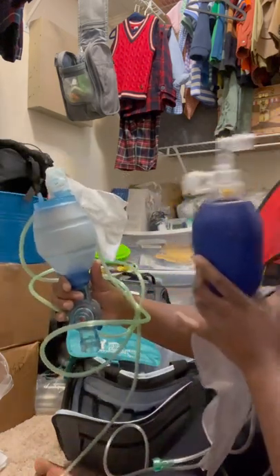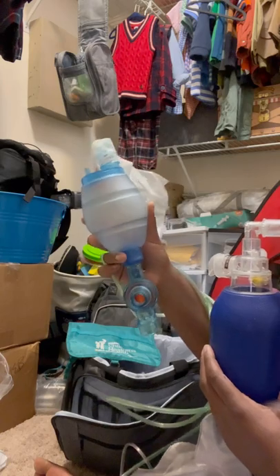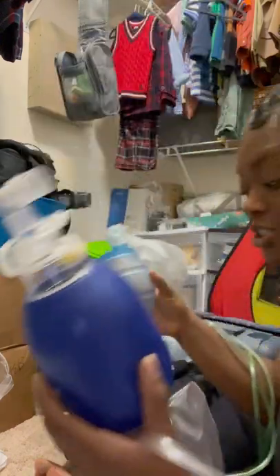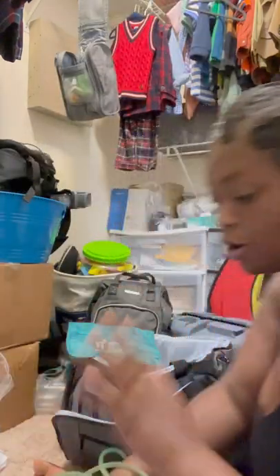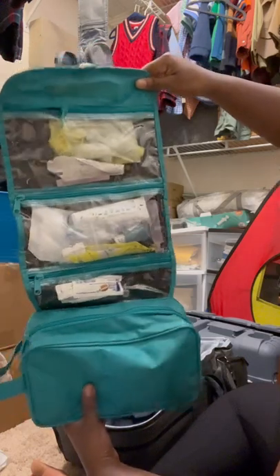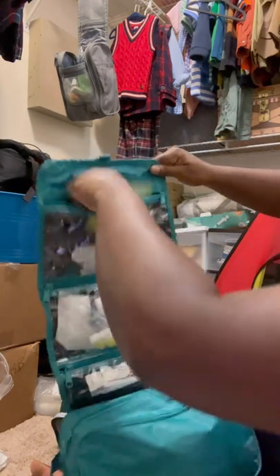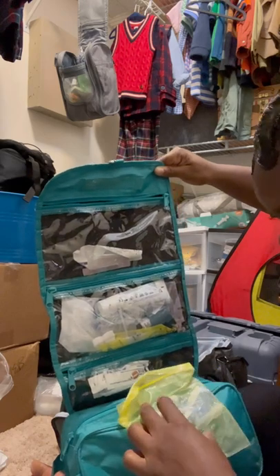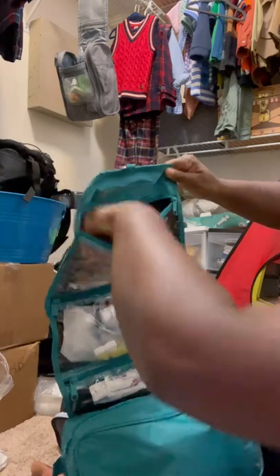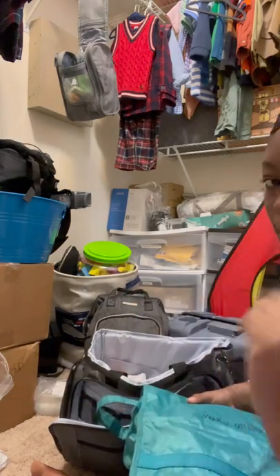I'm going to pack these ambu bags. This larger one I believe is what they gave us when Braylon was discharged from the hospital. They both work. This is also Braylon's go bag or his trach bag — I'm going to go through it to make sure everything is in order. This usually stays packed and I've never had to use it for an emergency trach change while out. I'm glad I'm checking because there's no obturator in this bag — I need to pack an extra trach and obturator.